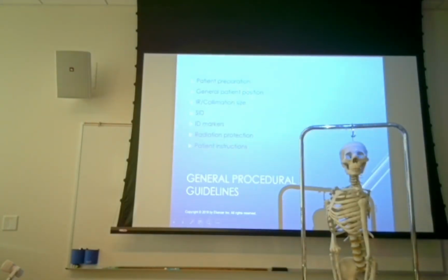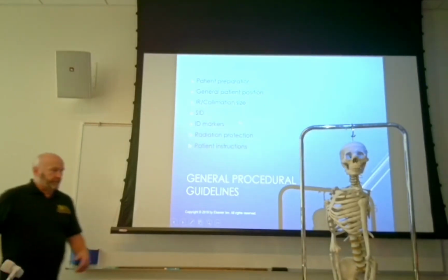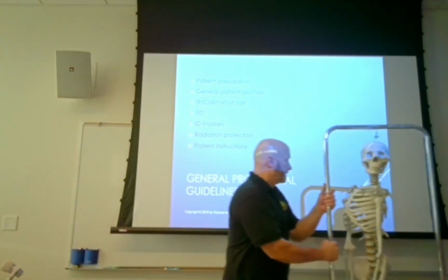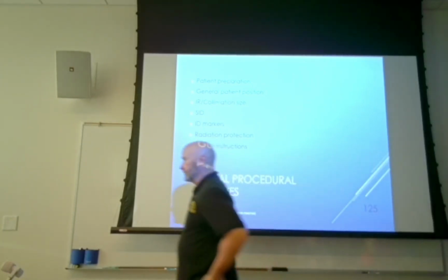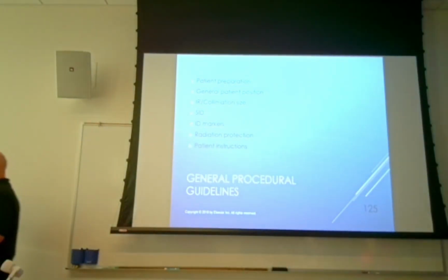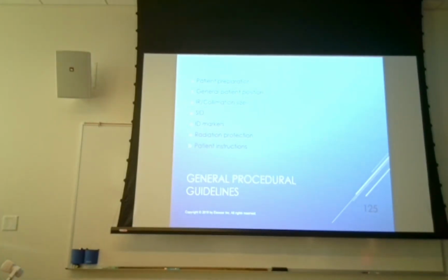Okay. So general procedures, I'm gonna get this guy out of the way for now. But general procedures, your trauma situations, you're gonna do 2 views, and you may have to deal with some artifacts, right? Because the patient can be on a backboard. But if it's a walkie-talkie patient that comes to you not on a backboard, then you need to get pretty much everything out of the way.